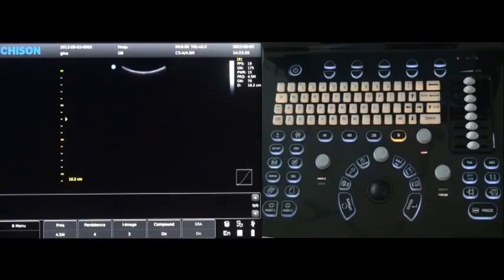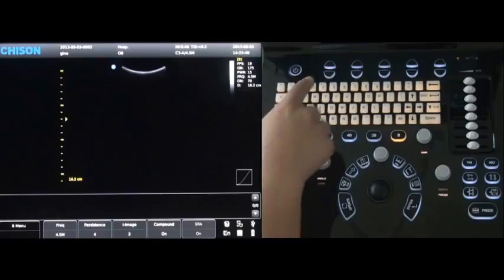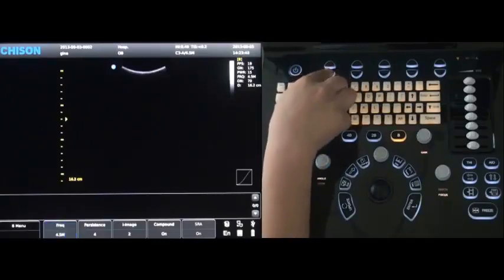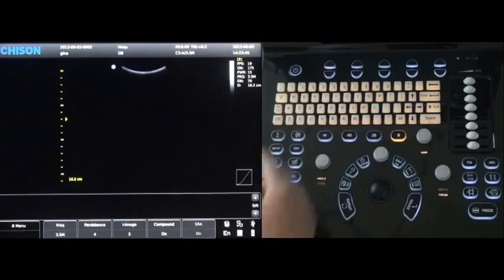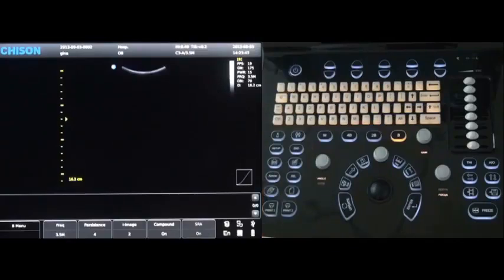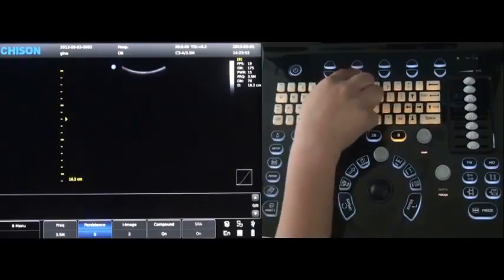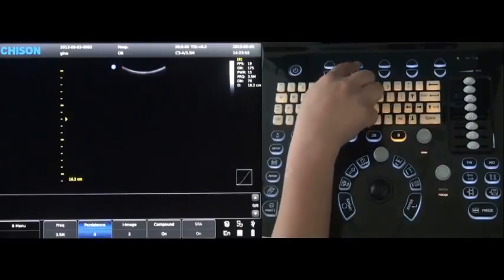Press the key to change the frequency, up or down. Press the second key to change the persistence, up or down.